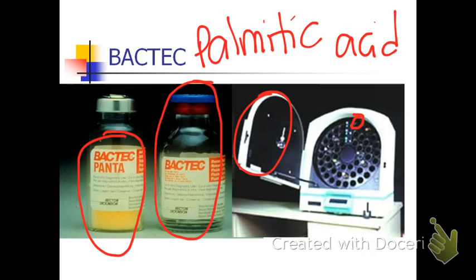If there is turbidity, the machine will alarm and tell us which particular vial is positive. So this is an automated way of telling that you are positive in the screening of the liquid medium. Again, if you are positive in BACTEC, then you have to re-inoculate the sample in solid medium. Usually, they use the LJ medium for this.